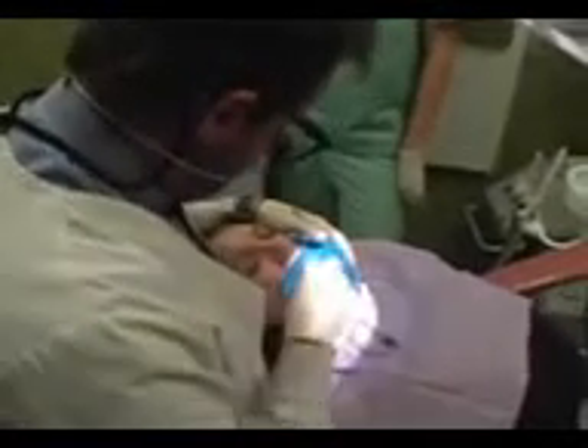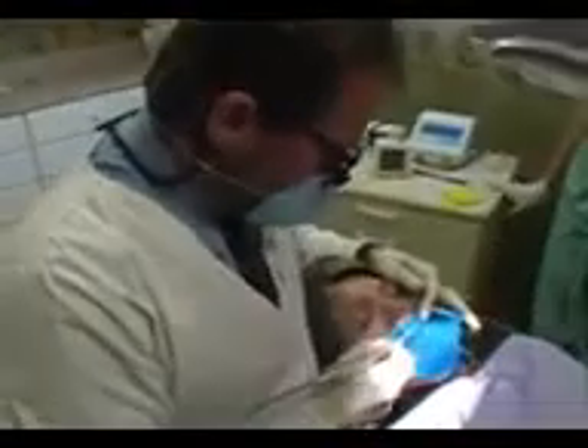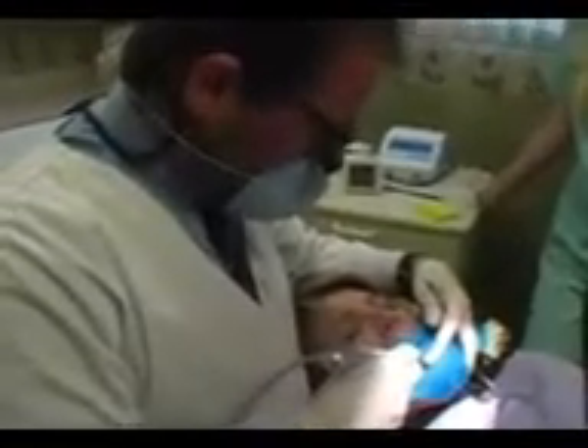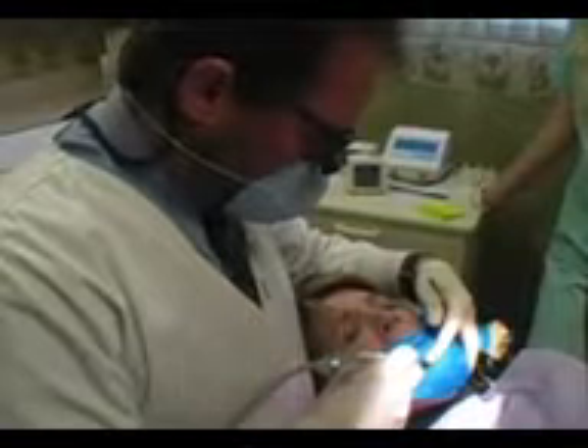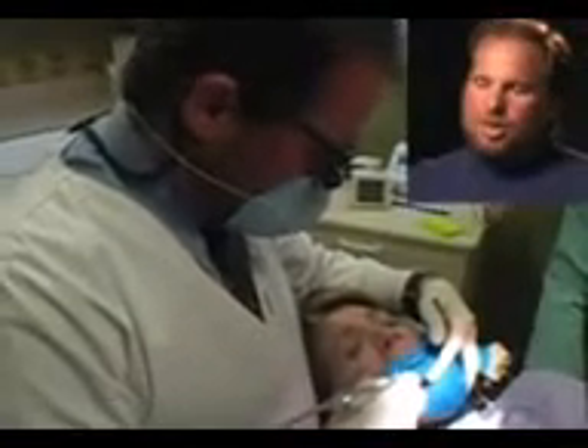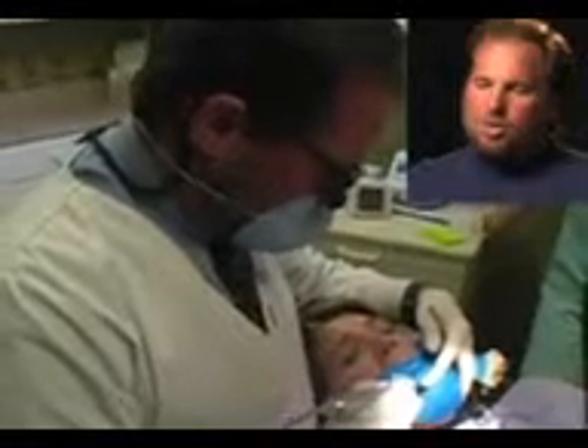I'm still verifying lengths. This tooth had four canals, and each canal has to be measured — which is what we're doing here, and my assistant is recording that as well. After we know the root lengths, I'm shaping the inside of the tooth roots using a rotary file on a slow-speed handpiece, which helps me shape the roots.